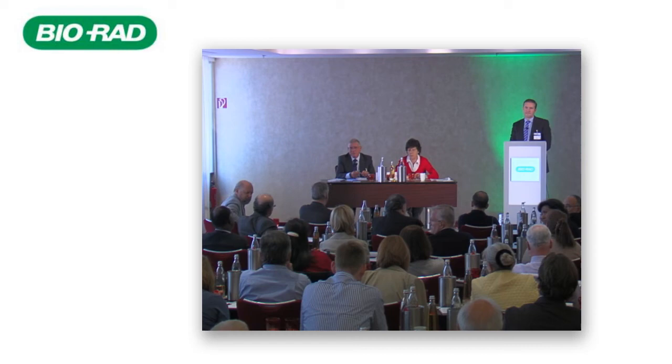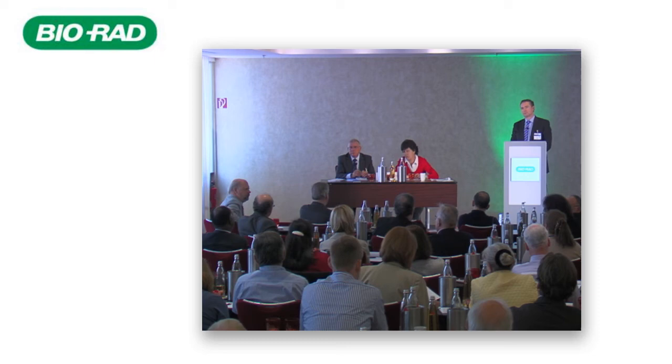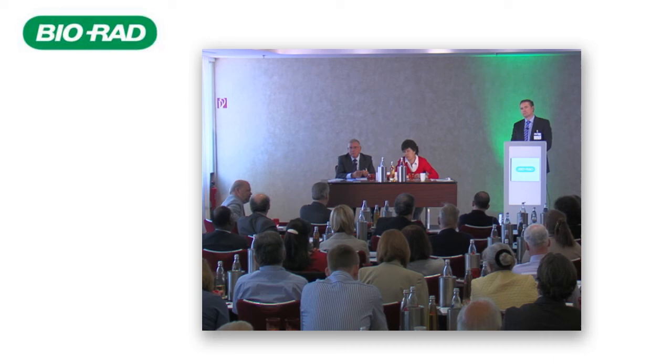Well, I think we still choose from what's available in the market. So, for example, creatinine assay, Jaffe versus enzymatic. It happens that now we have a good enzymatic assay, so there are good labs who choose the enzymatic and they can deliver what's required for the clinical need. But up to, say, 15 years ago, we didn't have it. We just had Jaffe and we had to live with it. And what I'm saying here is we need a more dynamic relationship and interaction with the manufacturer, because we choose from what's there in the market. If the technical capability is not there, we can't do anything about it until the manufacturer comes with something better.